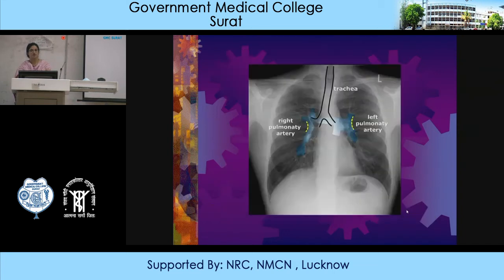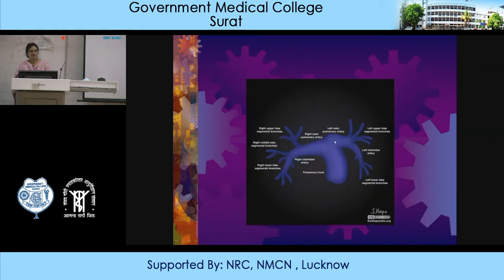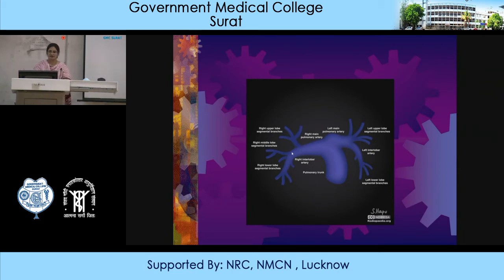You can see the bifurcation of the pulmonary artery into left and right pulmonary arteries. The left pulmonary artery gives rise to left upper lobe segmental branches, left interlobar artery, and left lower lobe segmental branches. The left pulmonary artery is higher. The right pulmonary artery leads to right upper lobe segmental branches, the right interlobar artery, right middle lobe segmental branches, and right lower lobe segmental branches.